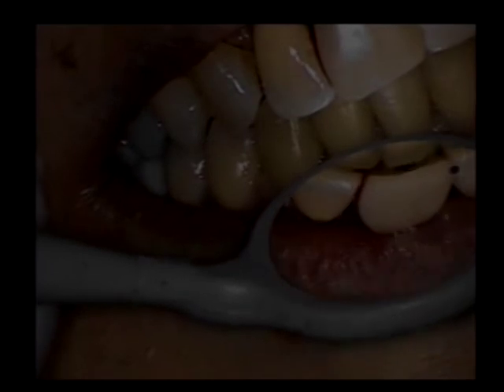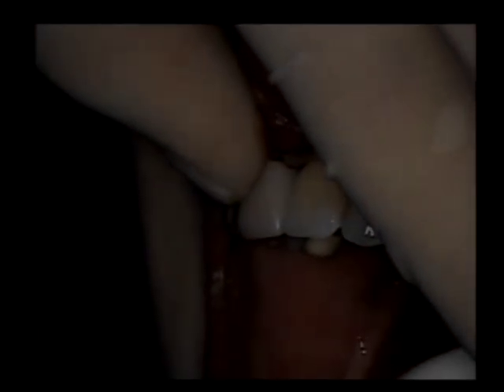If you can see with zero adjustment, that is not too bad at all. I think it's almost a bullseye — I don't know if we need to adjust it at all. One important communication thing, obviously, between the surgeon and the restorative dentist. It's almost exactly how we had planned it. By the way Mike, thanks for making my job easy. And thank you IGI for making my job easy.